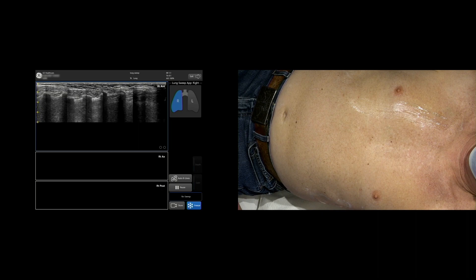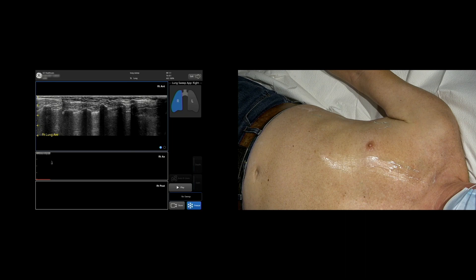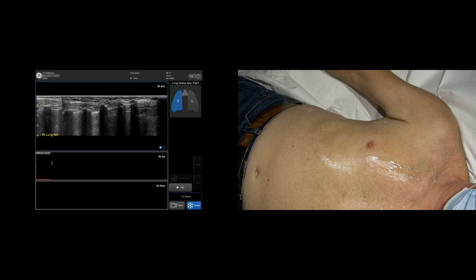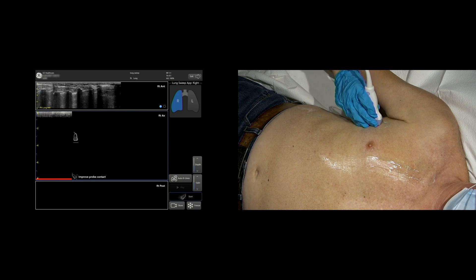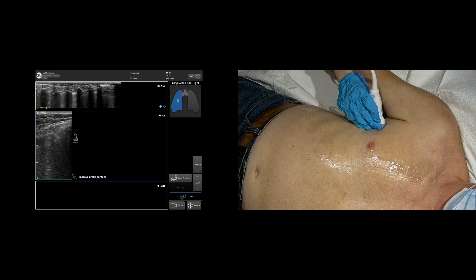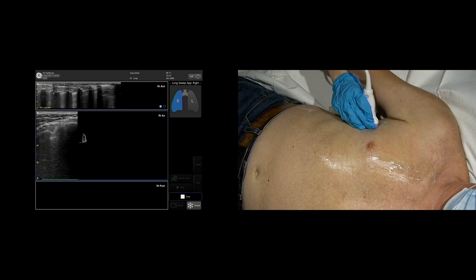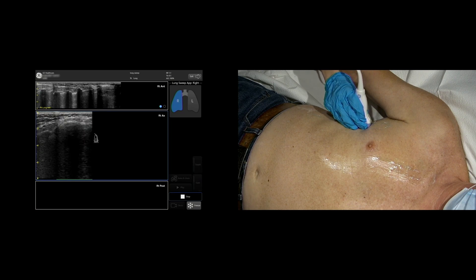Each sweep is automatically labeled. Labels are visible on the review screen. To begin another sweep, tap Freeze or tap Re-sweep. When you're ready to perform the next sweep, tap the View. Tap Start or simply lift the probe and set it back down again to begin your sweep.